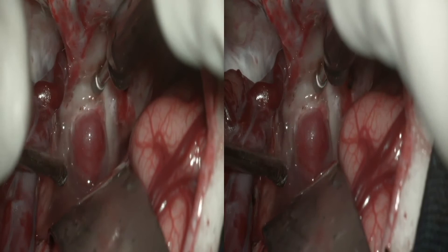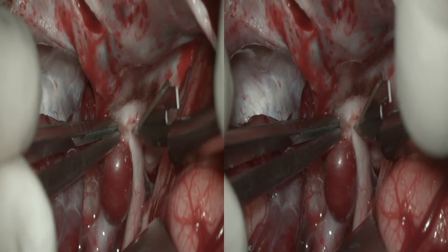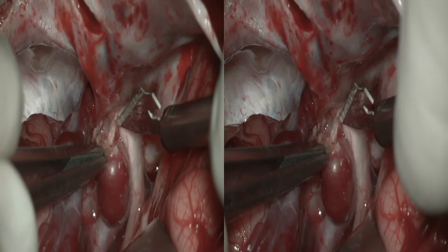The anterior clinoid process has dense cortical bone along its surfaces and cancellous bone at its core. With a number 11 scalpel and high magnification, an incision was performed in the lateral border of the optic sheath. This allows better access to the upper carotid ring.